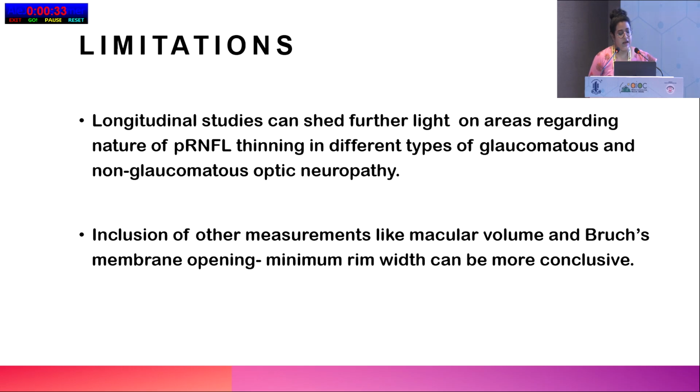So the limitations of this study are that a longitudinal study can better help to establish the results of this study, and inclusion of other measurements like macular volume or BMO minimum rim width can also be more conclusive, but RNFL remains the superior criterion.